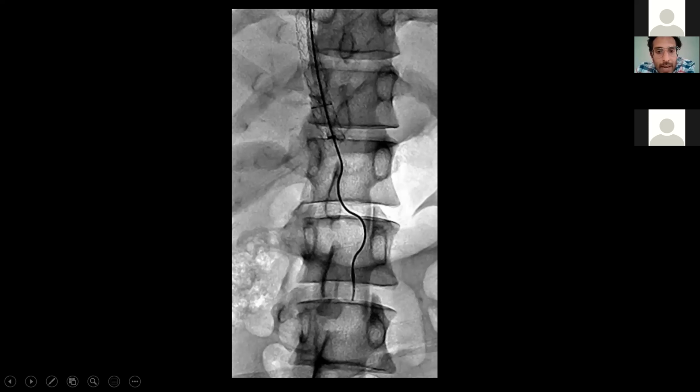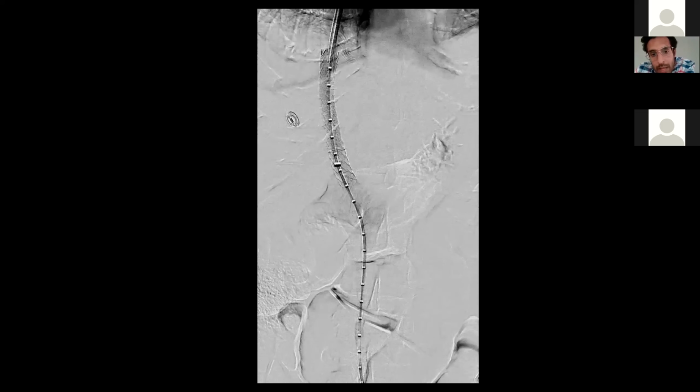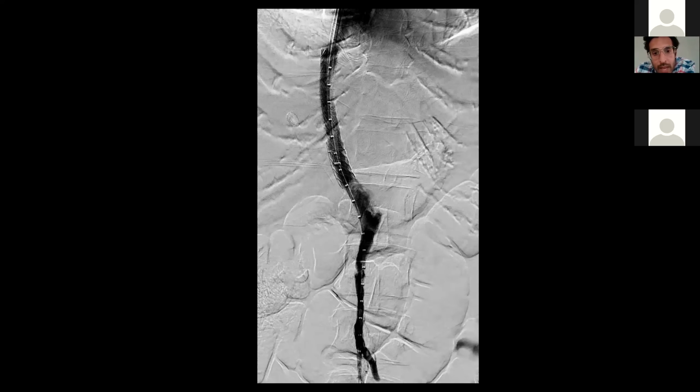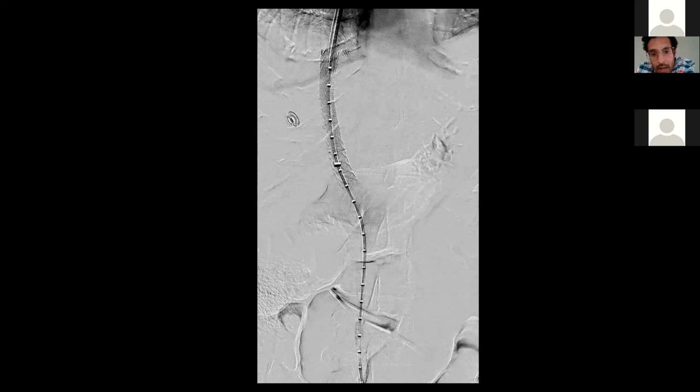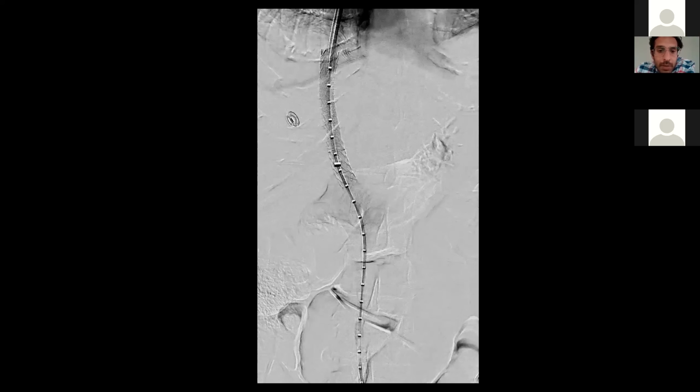So at this point, now that we have an outflow, we've lysed this for a day. We brought the Cleaner in, and again, really tried to clean that out as much as possible. And this was what we were left with after that. So it did a really nice job of clearing the channel again. Now that we had an outflow, I think it really helped.